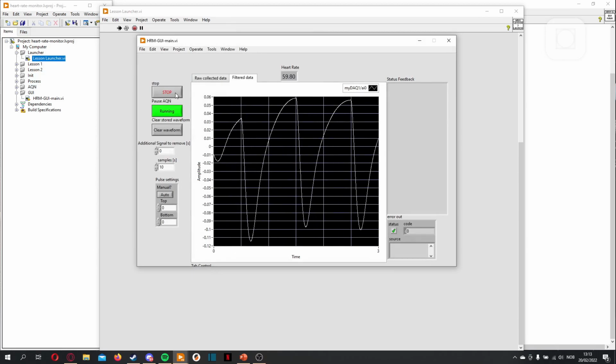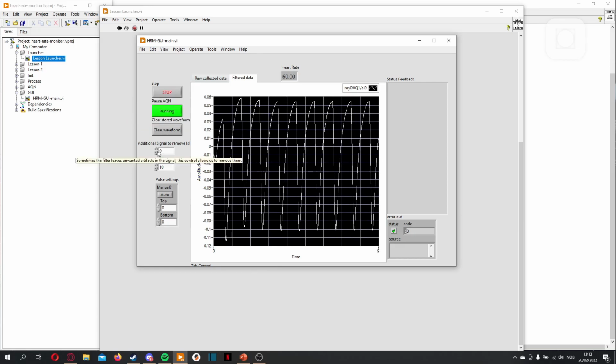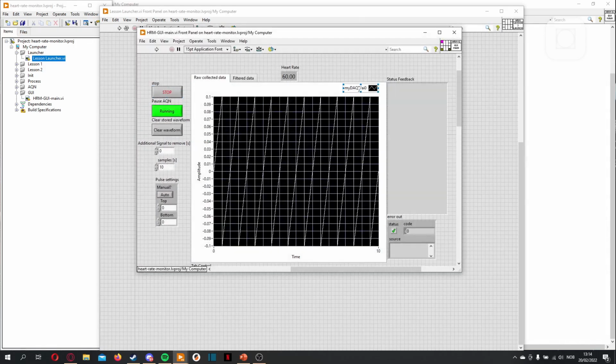Now we have our things, and we hover over here, and we see all the information. This can help you convey more complicated things to your users. Well, that's it, I guess. So we could add something more here or here, but we won't. I think this is self-explanatory, and status feedback, well, I think I will just say status feedback with more words. I can't really explain it any better. So that's it for that one.